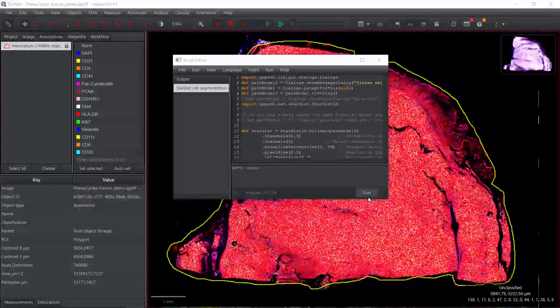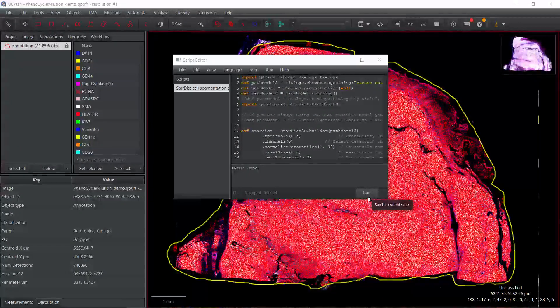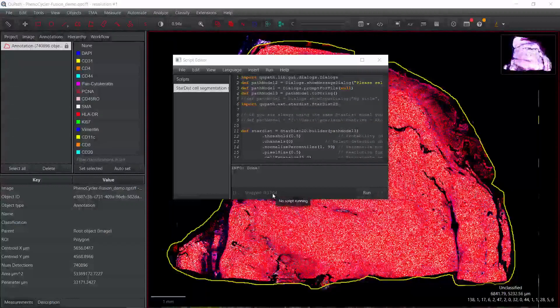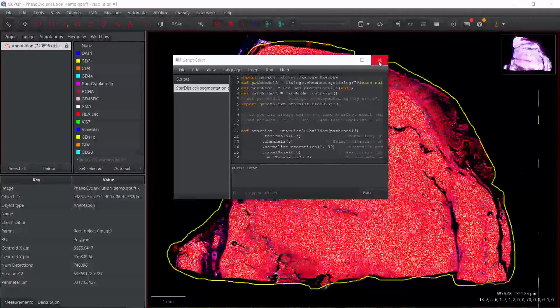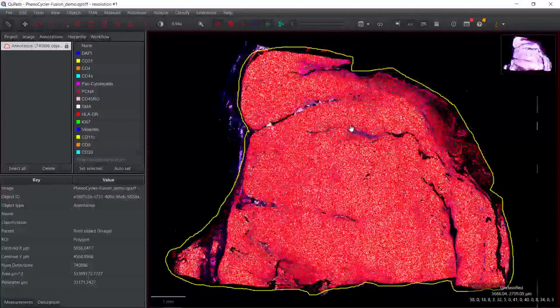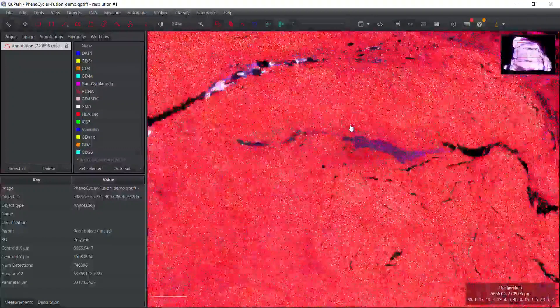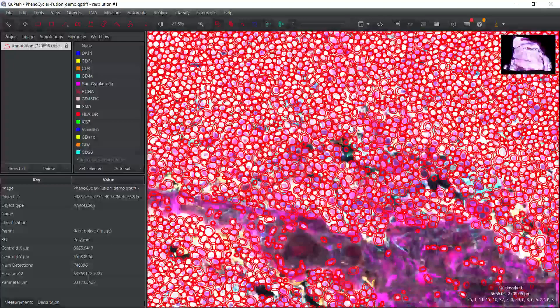You can see QPath finished the cell segmentation. It took 37 minutes for the whole tissue. Let's have a look at the segmentation result. We can zoom in. You can see it's pretty good. So next, we can perform the multiplexed analysis.